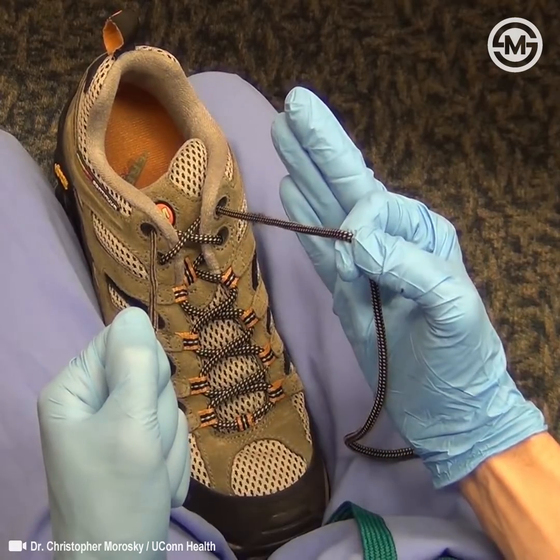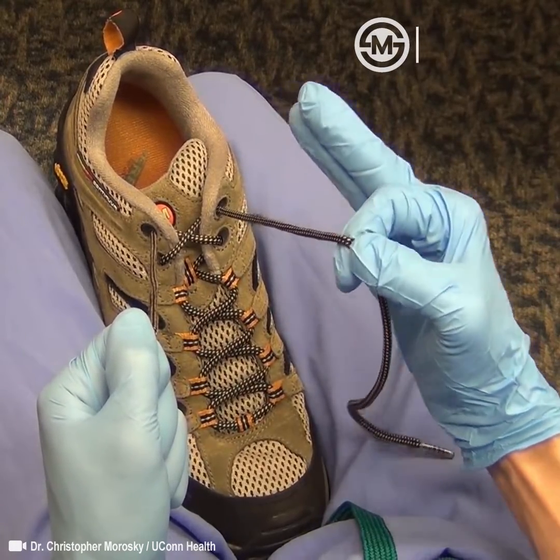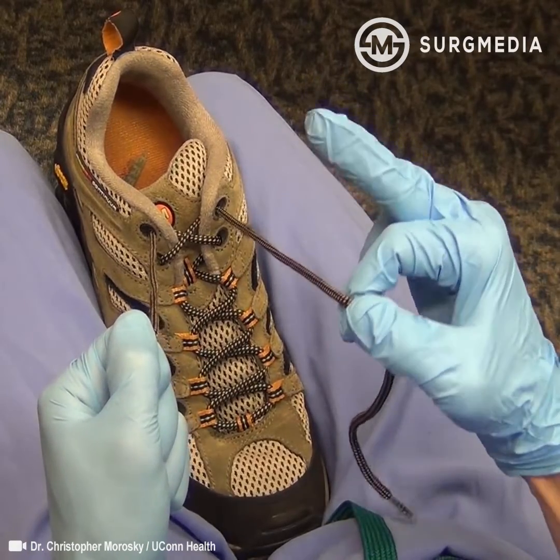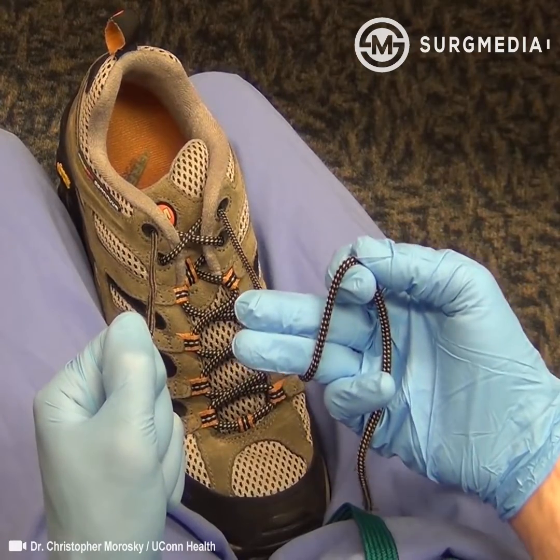For the karate chop, you make the letter D. I usually pull on my finger and just hold my middle finger and my ring finger out. With this, you want to do an internal rotation — or karate chop — down on your suture that you're holding in your tying hand.